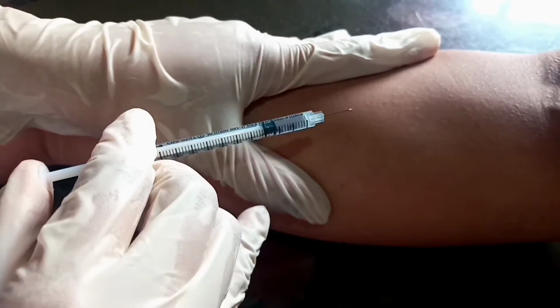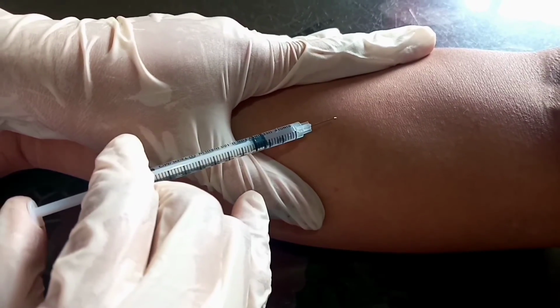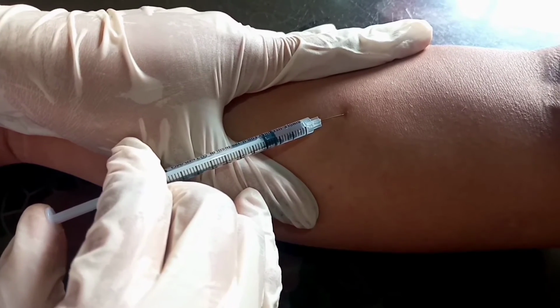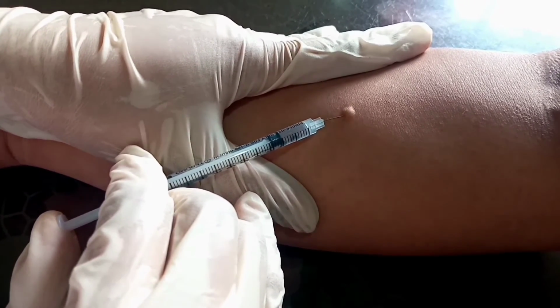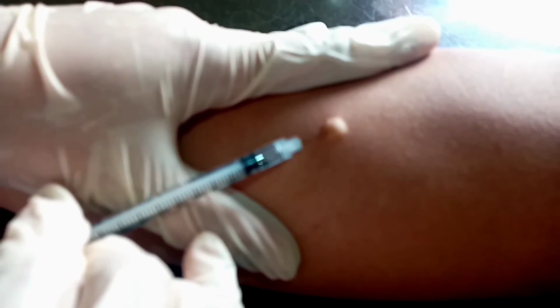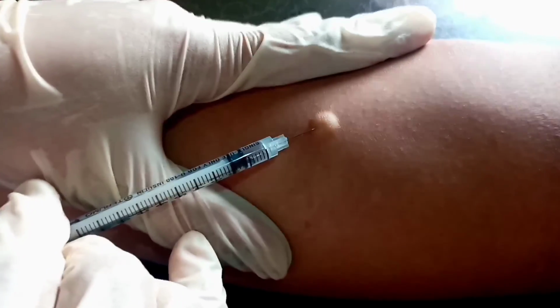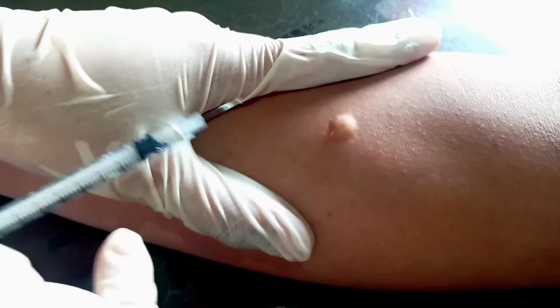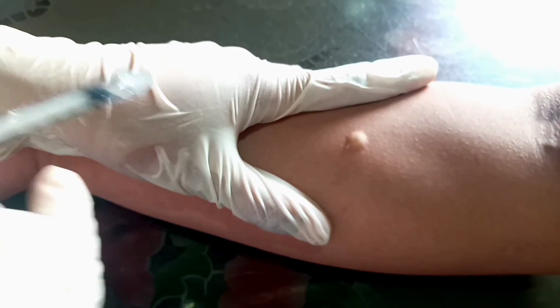So let's do it. Right after, we withdraw the needle quickly at the same angle at which it was inserted.